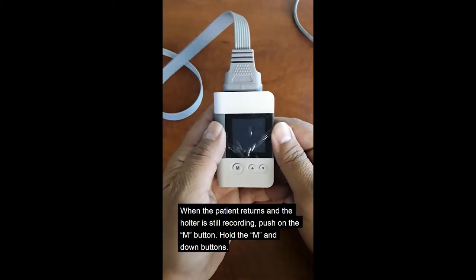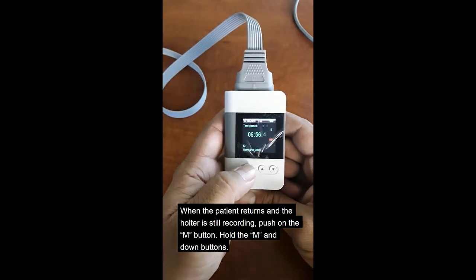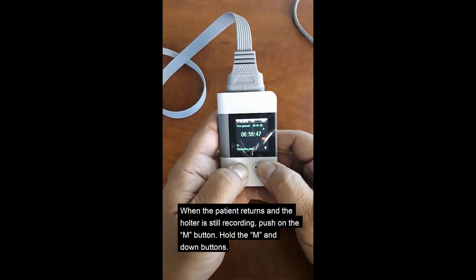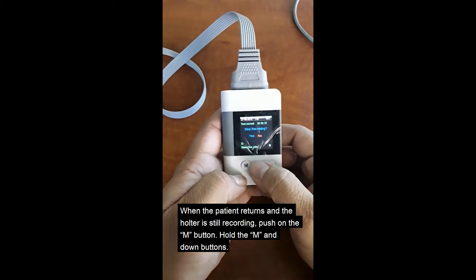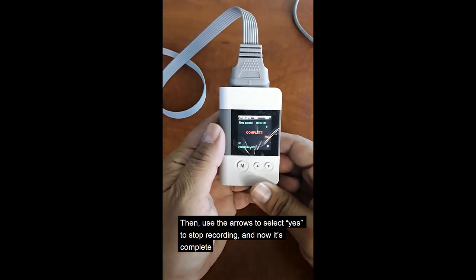When the patient returns and the holter is still recording, push on the M. Hold the M and the down button. Use the arrows to select stop recording. And now it's complete.